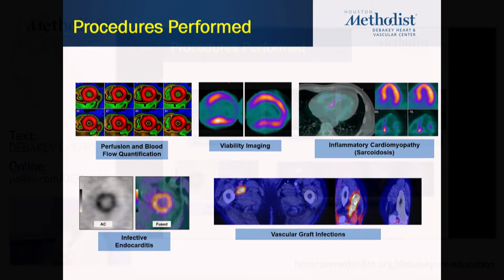Okay, great. Last question for you here. In the next 5 years, where do you see PET CT taking off, and what different modalities is it going to be used for? So obviously for myocardium, it will continue to progress. I think we're going to start to see some more of the non-perfusion applications become more clinically available.